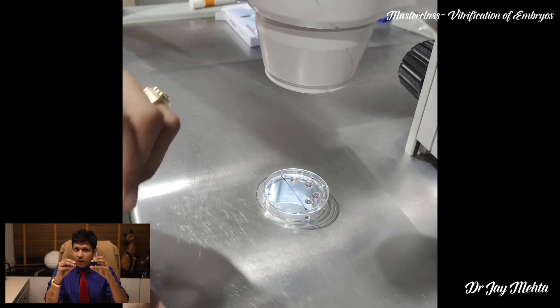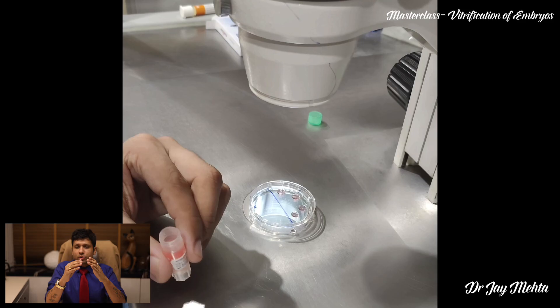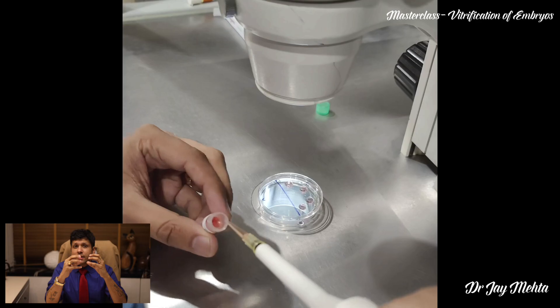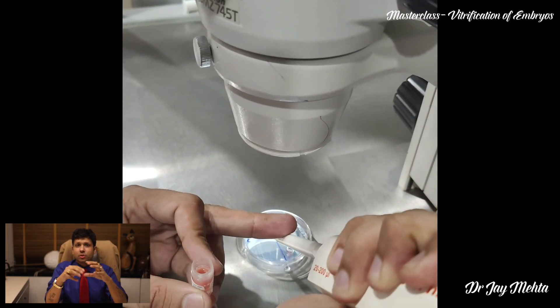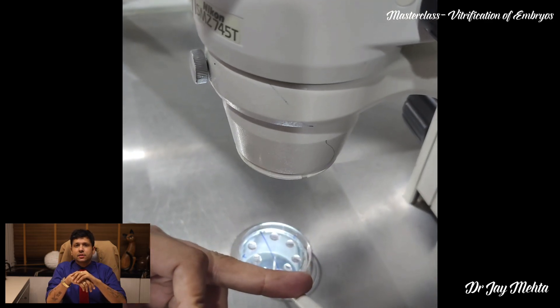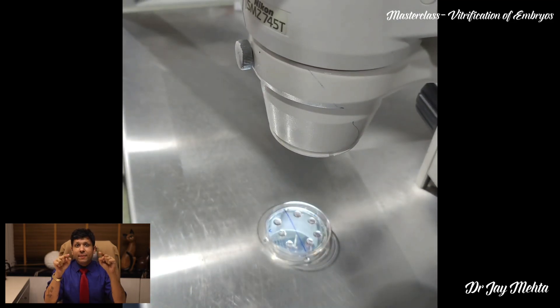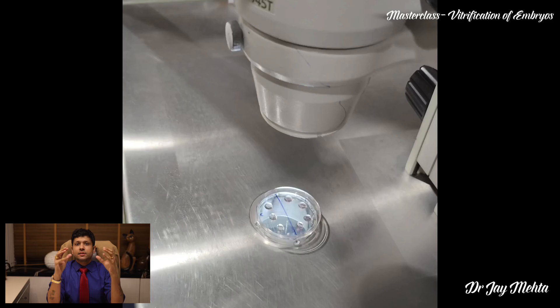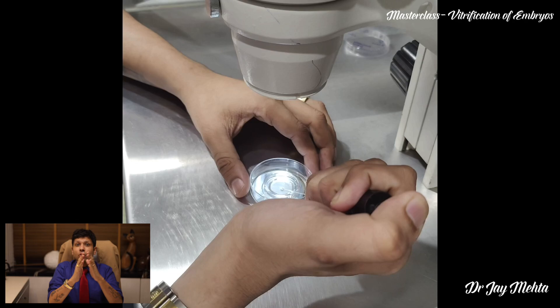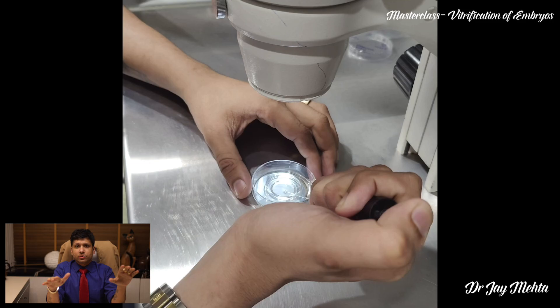The equilibration solution contains sucrose in a slightly lesser concentration. That is why you need adequate exposure in the equilibration solution — this exposure is usually going to be around 12 to 14 minutes. What sucrose does is that it combines with the lipid layer present on the cells, so that when the cells undergo dehydration there is no damage. If you dehydrate any human cell it is going to necrose — it is going to die — and you do not want the human embryos to die.